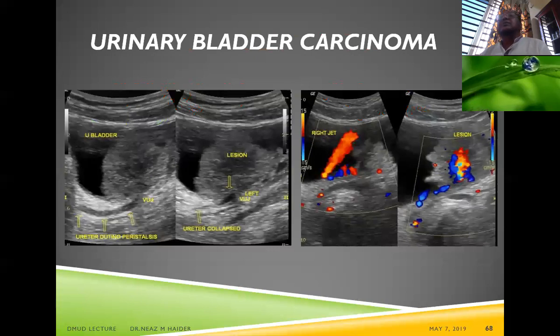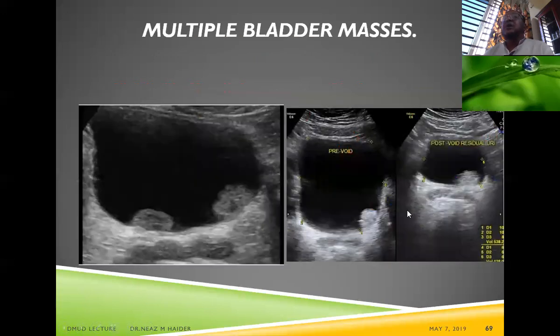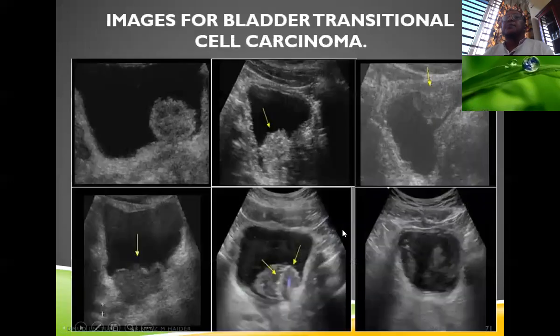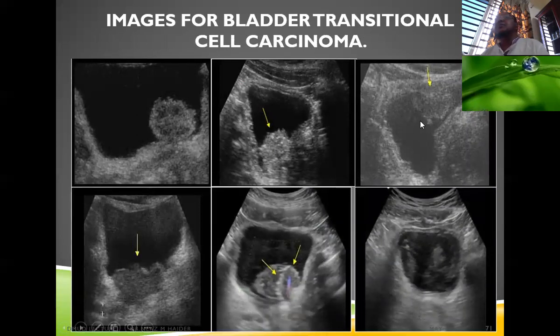Carcinoma cases are shown: a large irregular mass on the bladder wall with vascular flow on color Doppler, multiple masses within the urinary bladder, and a large mass occupying almost the entire lumen of the urinary bladder — all representing transitional cell carcinomas in multiple patients.